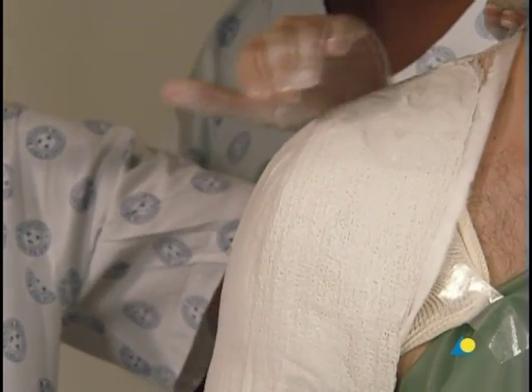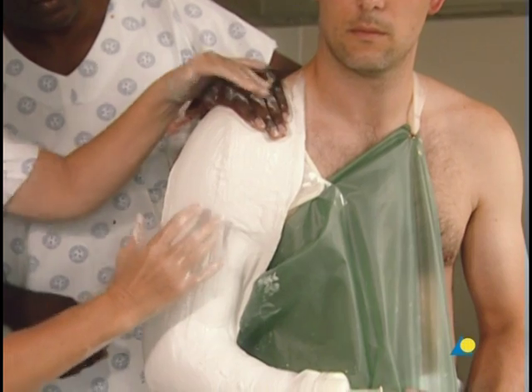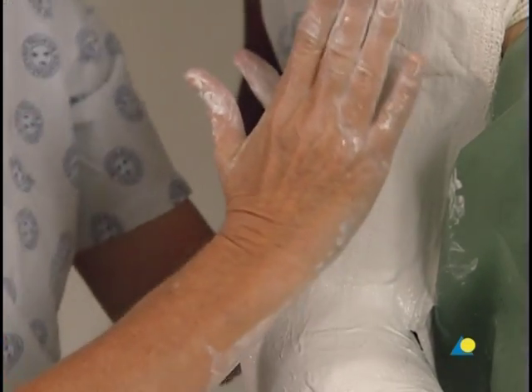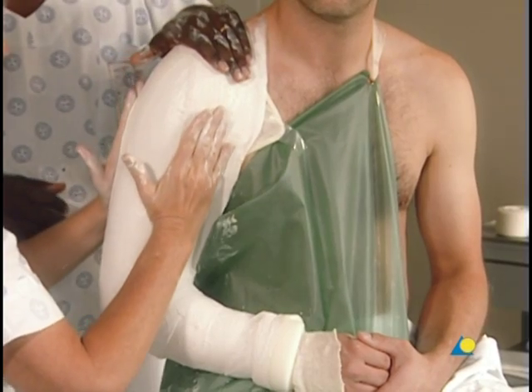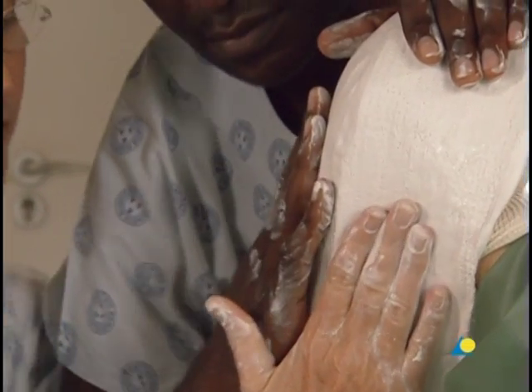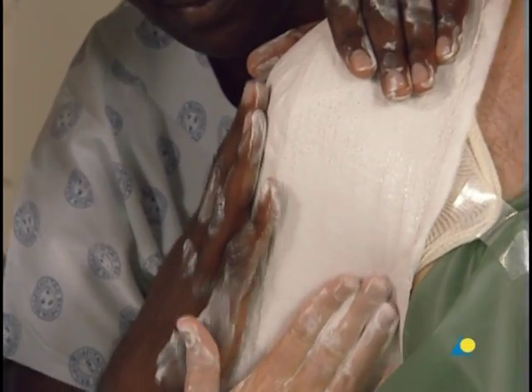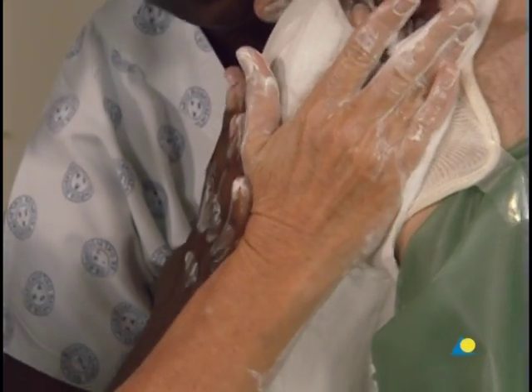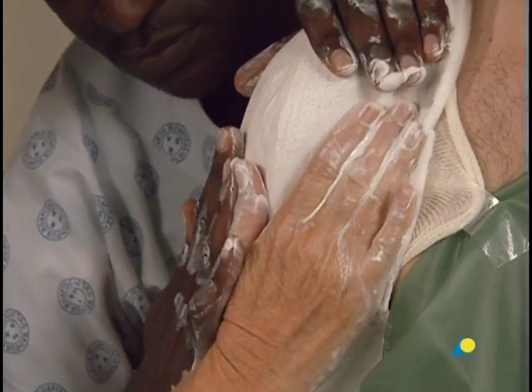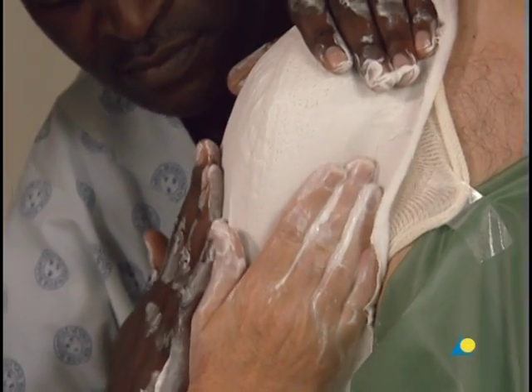The splint is molded as shown. The assistant applies pressure on the shoulder with one hand, while two hands are used to apply anterior and posterior pressure. The assistant's second hand applies pressure medially. Even support at both the humerus and shoulder is ensured by molding with the hands until the plaster has become completely dull, indicating that it has set. Often with an extremely unstable fracture, any loss of reduction can be felt while molding.